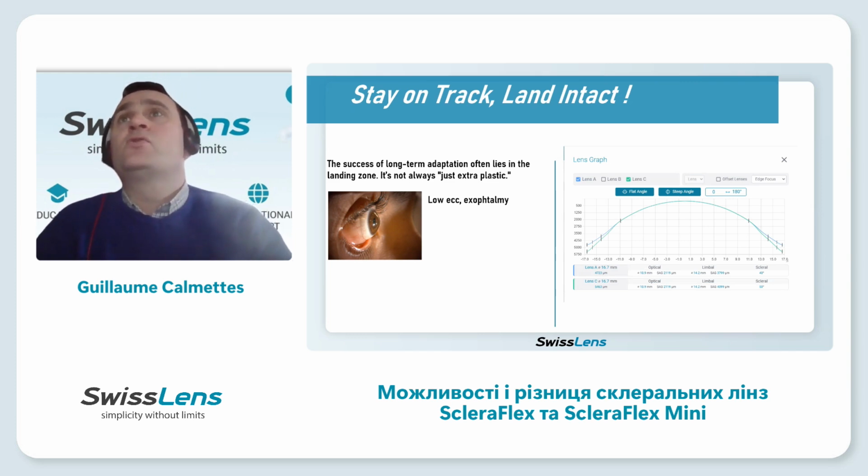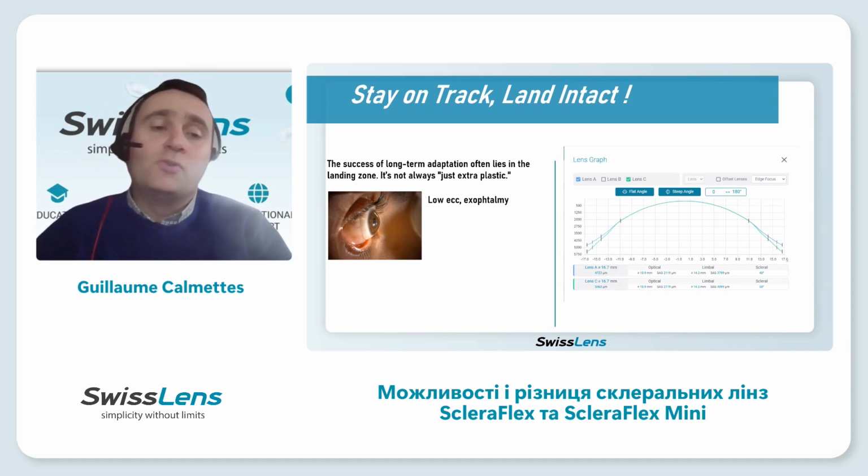And it's not that easy. In ScleraFlex, you can do something like that. And it's a huge difference between both. There is 10 degrees, so that means something like 1,000 microns. It's huge.